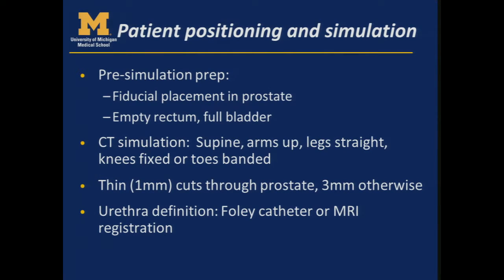For patient positioning and simulation, it's very important to do a pre-simulation prep, just as patients have done for fractionated therapy as well, but even more important for SBRT because with fewer fractions, you have less room for error. Typically, we have fiducials placed in the prostate, whether they're just standard markers or tracking markers. The empty rectum is very important because we want to have a very consistent prostate position relative to the rectum as well, and a full bladder to get the bowel out of the way.